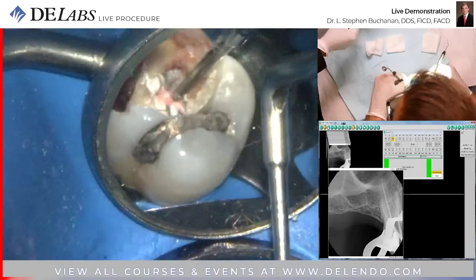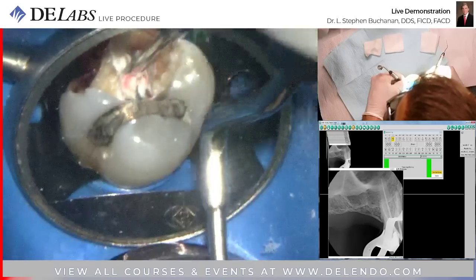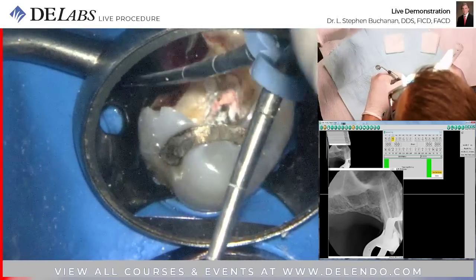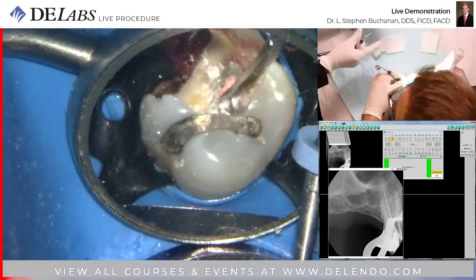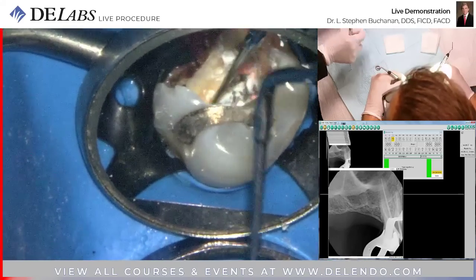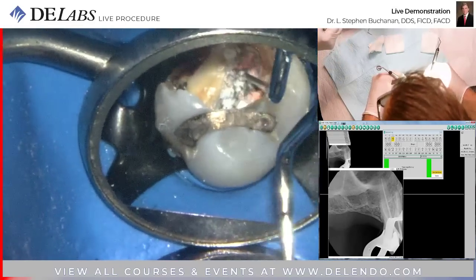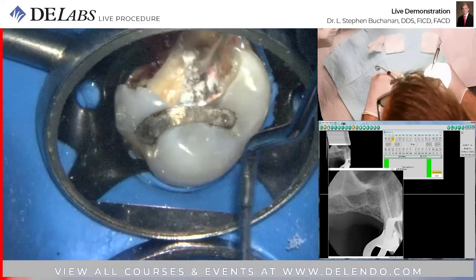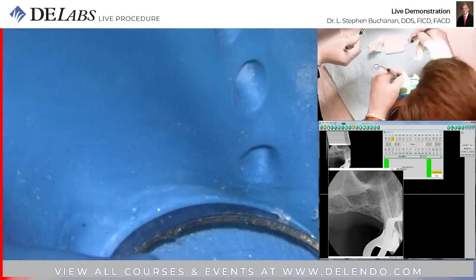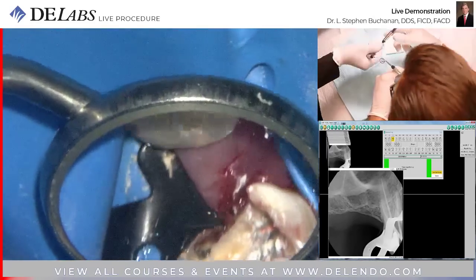God, I really like these handles. Cutting with the side of the plugger is really effective. Need the 40 again. We do a sustained condensation force on the MB2 here. This is the Nitai end. Can I have the, oh no, this is the 90 end. Here's the stainless end. Oh, yeah, I'll take the 70.